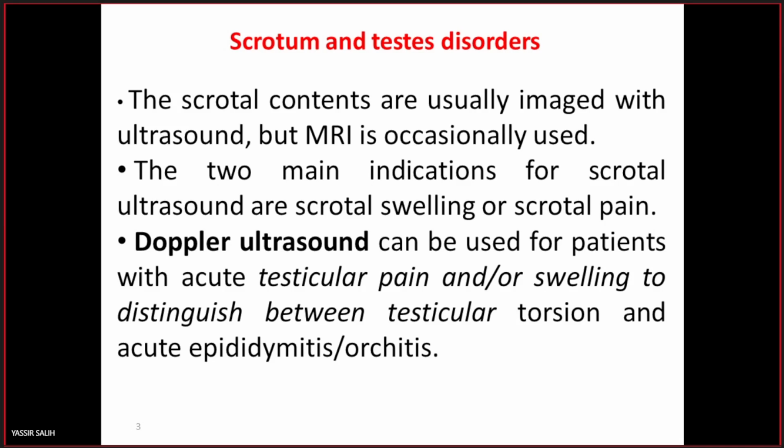In ultrasound, there may be a technique called Doppler ultrasound. When we say Doppler ultrasound, this means ultrasound in which we use a technique called Doppler for evaluation of the blood flow, to assess the blood flow within the arteries and veins.